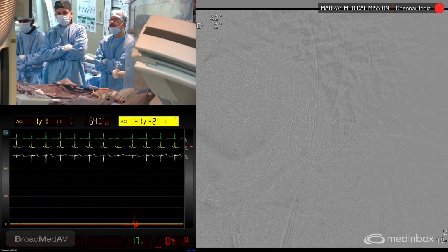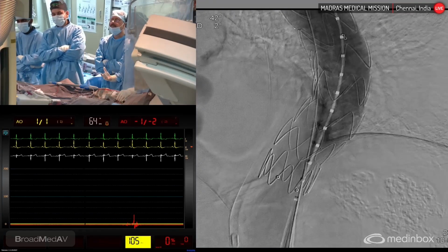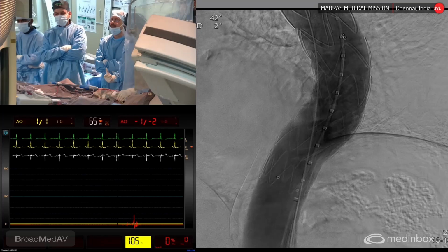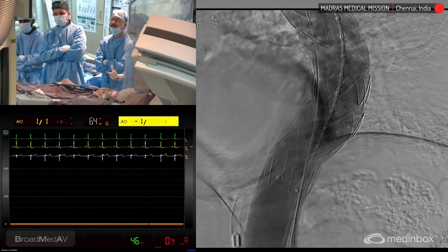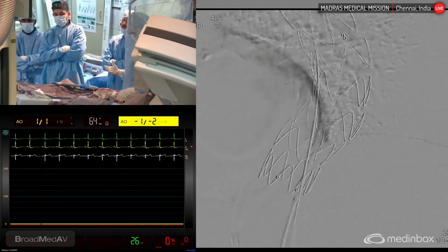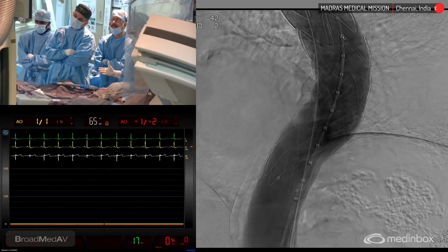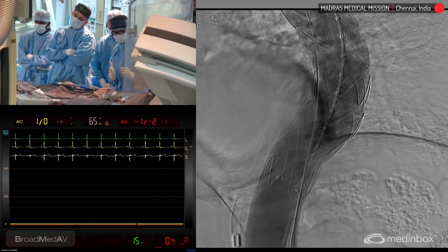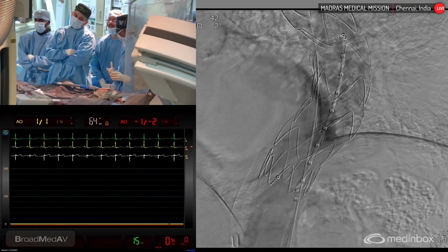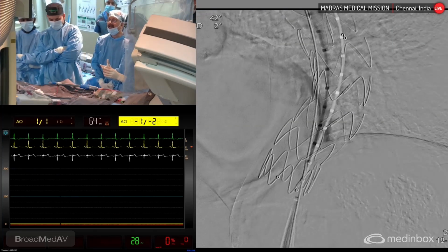Now my question, maybe it's a basic question in the fellow's mind or in the general physician mind. Should we need to put a graft for a thrombosed aneurysm where the lumen is absolutely okay and there is no tension on the aneurysm? Is a graft at all required? After seeing that second question, where is the location of the aneurysm, just struck my mind. I think somebody is trying to ask, is it at all required?